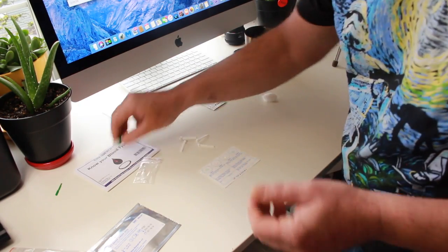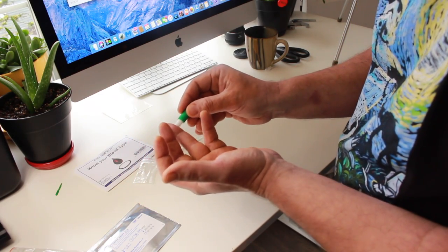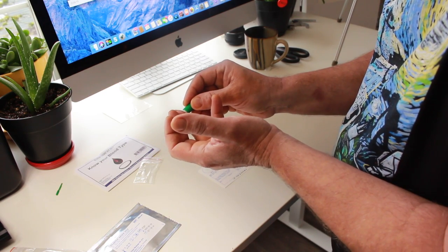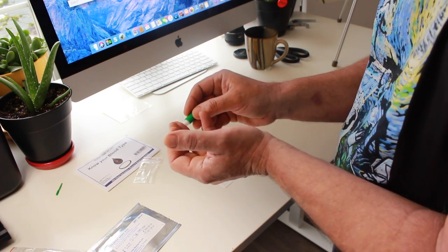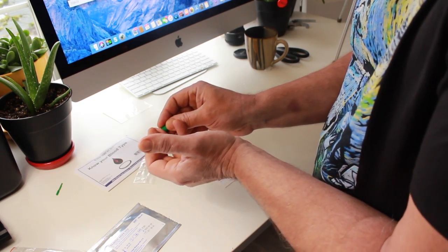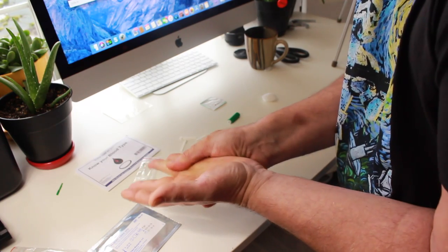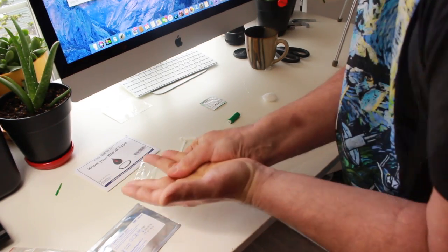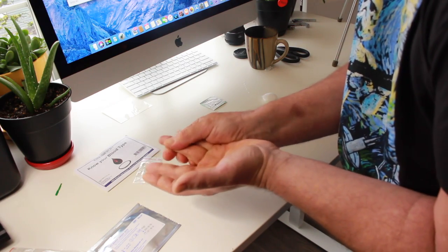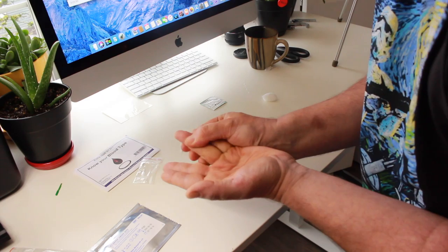All there's left to do really is to stick your finger. Here I go, I'm gonna stick my finger. Didn't hurt. Get the blood to flow. I don't got much blood on this, okay, here it comes. Just keep milking it, just keep squeezing it. Get a nice drop of blood on your finger. The prick didn't hurt at all.